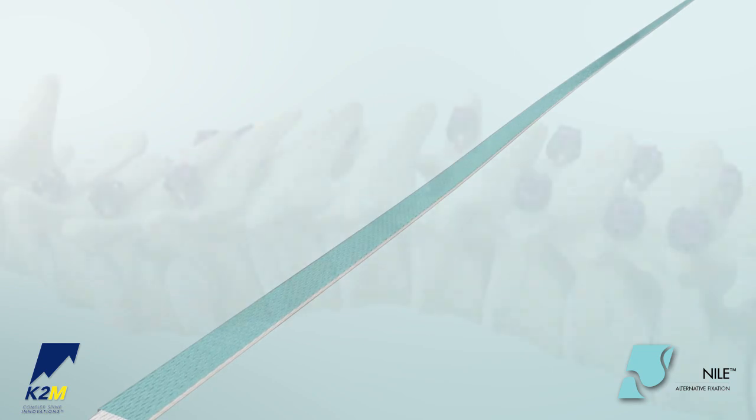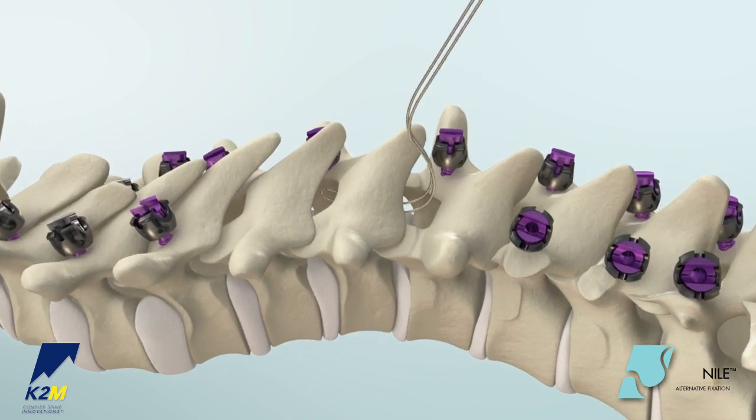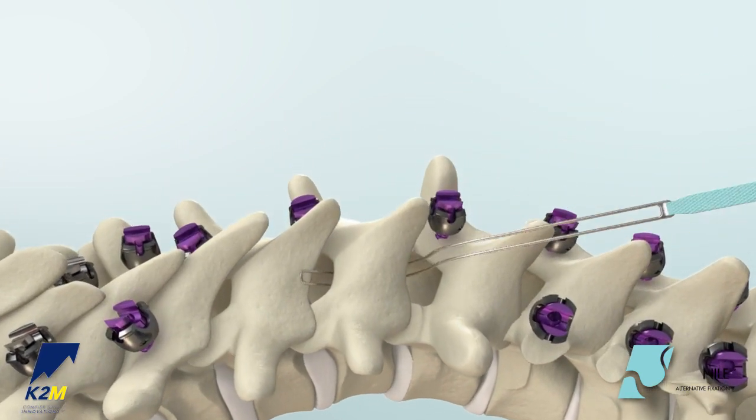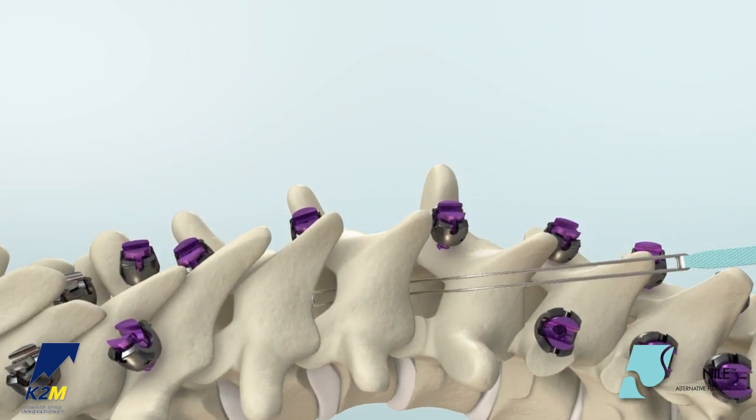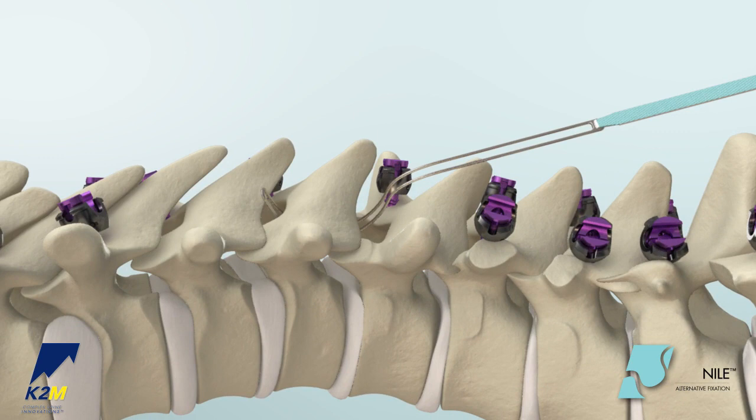Special care should be taken when passing bands during sub-laminar use. Carefully pass the bent leader underneath the lamina, caudal to cephalad. It is recommended not to twist the band during the passage. To avoid pushing the band into the dura, maintain upward pressure against the anterior aspect of the lamina by pulling up the tip of the band while advancing the malleable leader.